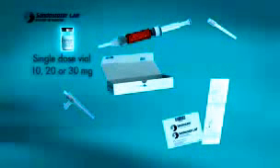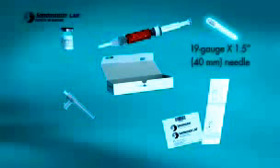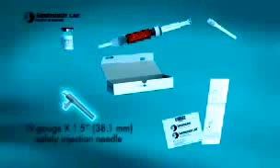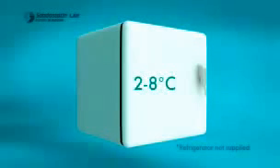Each kit contains 1 vial of Sandostatin LAR 10 mg, 20 mg, or 30 mg octreotide acetate for injectable suspension, microspheres for depot suspension, 1 pre-filled syringe containing the diluent, 1 19-gauge 1.5-inch 40 mm standard needle for transfer and drug product reconstitution, 1 19-gauge 1.5-inch 38.1 mm safety injection needle, 1 instruction booklet, and 1 leaflet. The kits should be stored in a refrigerator when not in use. Keep vial in the outer carton in order to protect it from light.